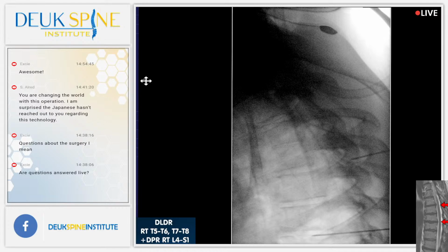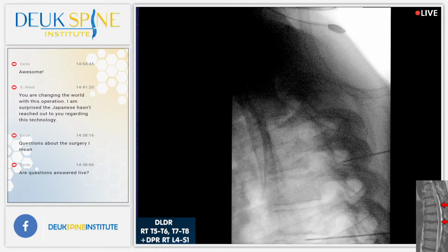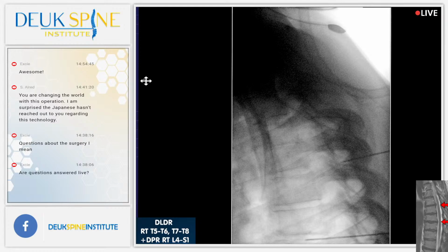Try the other direction. Try a little bit more. It's hard for me to say. What do you think? No, I agree with you. It is difficult.